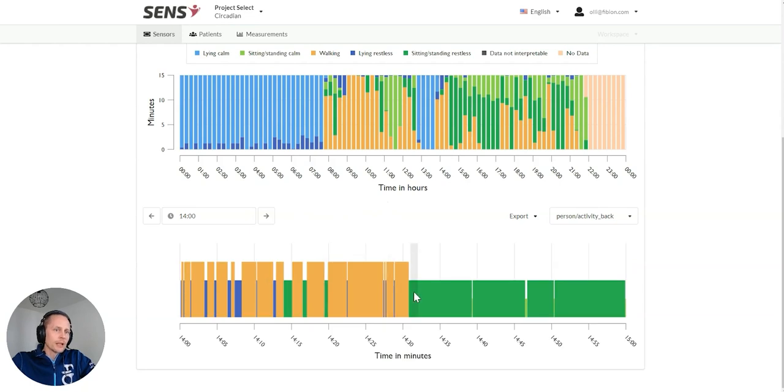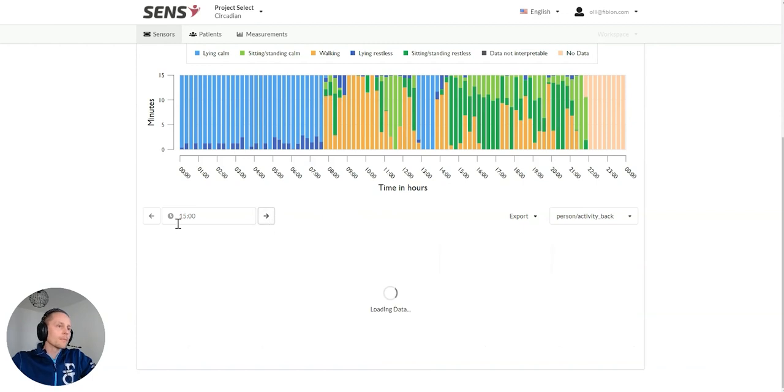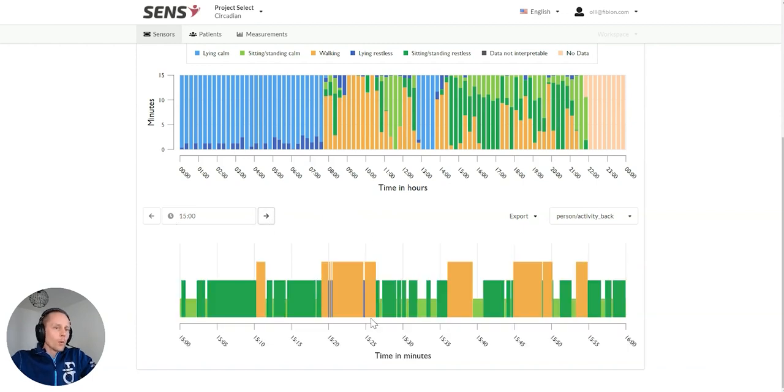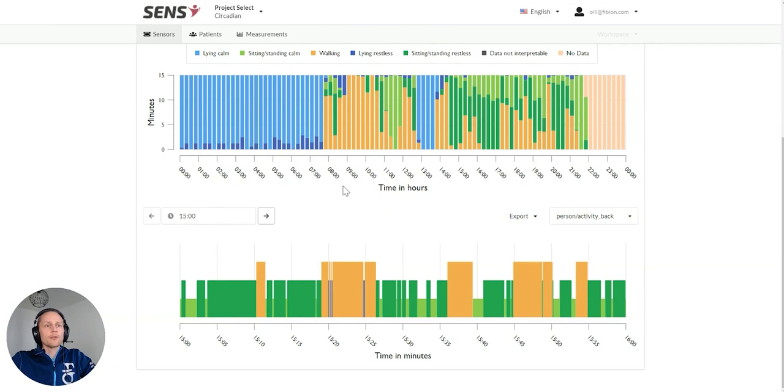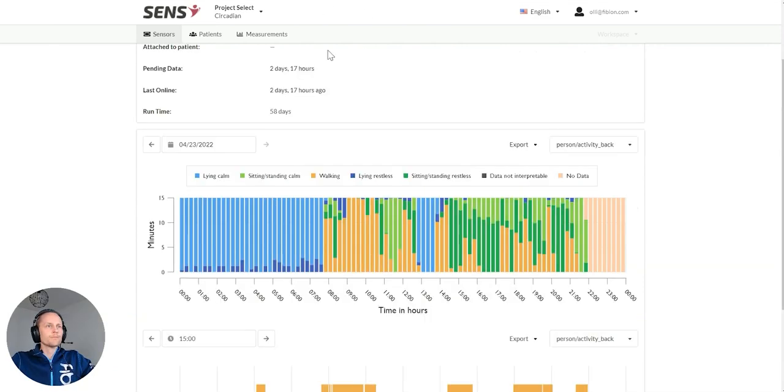We can see more accurately that person has woken up 7:46 in this case. And anywhere you want to click on the data, we can zoom in into data and go one hour forward and see what has been happening at any point of time.